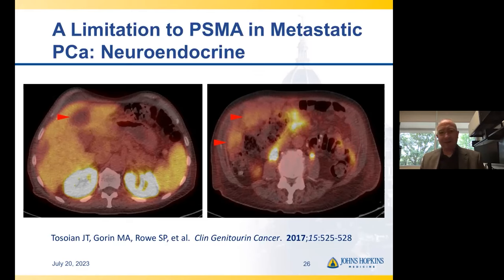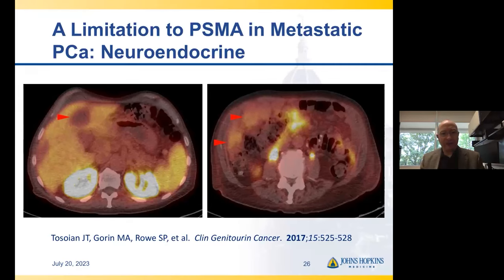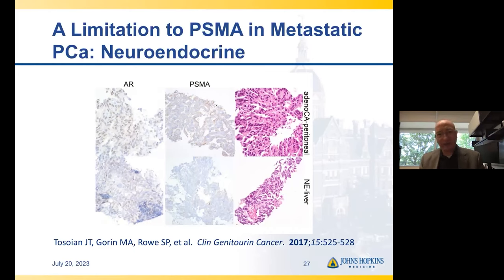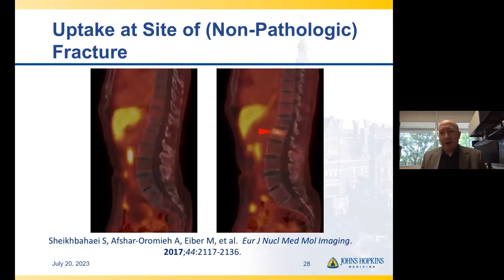Obviously if everything hot on the scan is cancer and everything not hot isn't, life would be easier. But there are pitfalls in both directions. A scan with negative or variable uptake may indicate neuroendocrine prostate cancer, which tends to lose PSMA expression. You can have biopsy-proven positive liver metastases in a patient with no PSMA uptake. Histopathologically, adenocarcinoma has PSMA expression, but that expression is lost in truly neuroendocrine-differentiated prostate cancer.